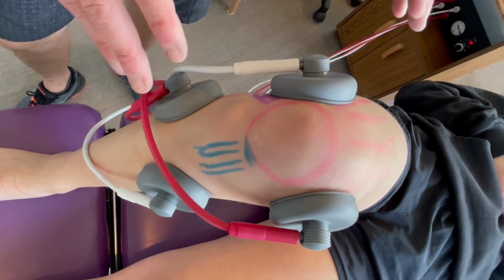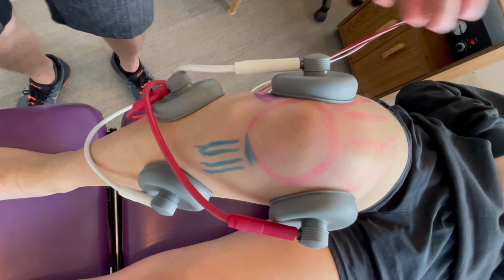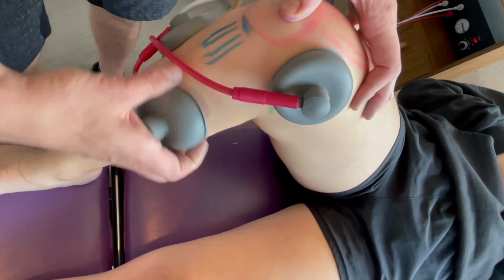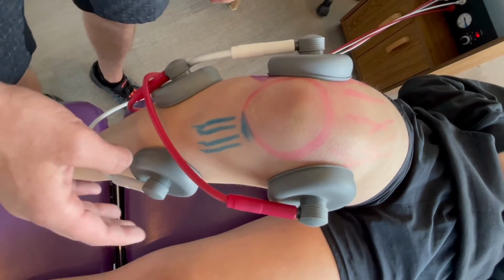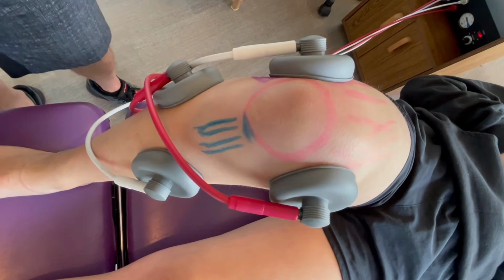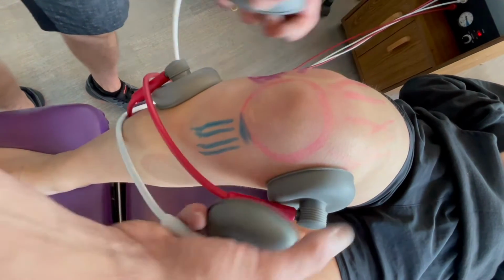So most knee pains are going to get an IFC machine to start with a heat pack for 8 to 10 minutes. If it's a hamstring injury, we might move the machine a little higher. If it's a medial meniscus, we might have something in here. A patellar injury will be a little different. Lateral will be a different angle too. But about 8 to 10 minutes, sometimes 12 minutes, with the IFC machine and a heat pack, just to stimulate blood flow and loosen up tissue. It really loosens up the knees, and most people with knee pain are stiff.